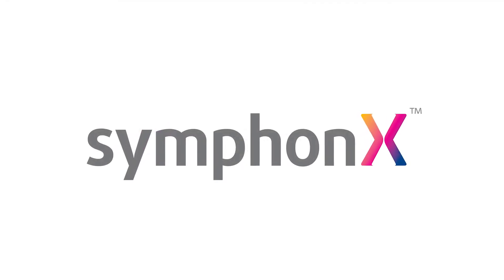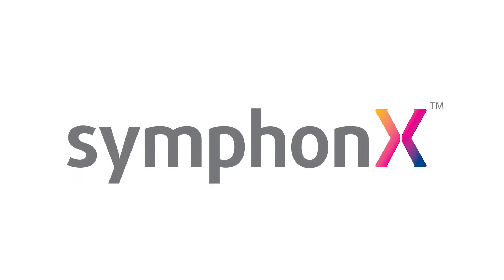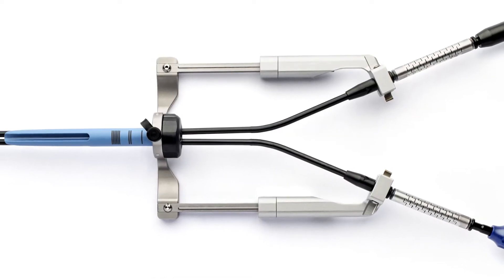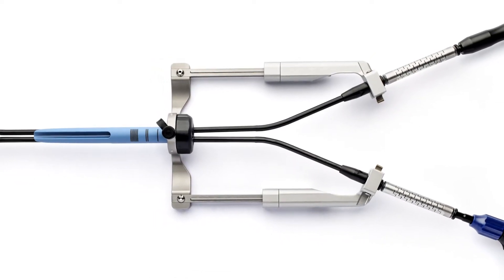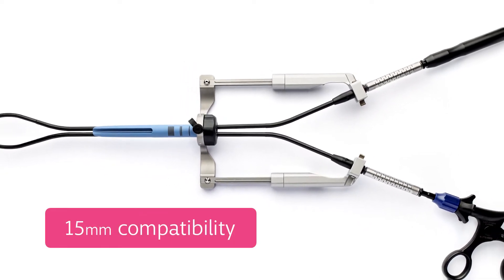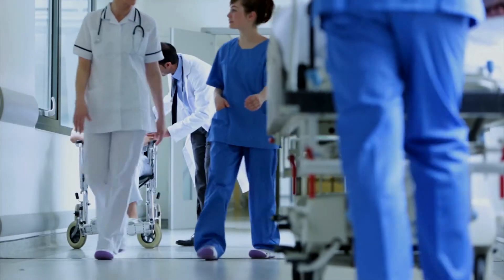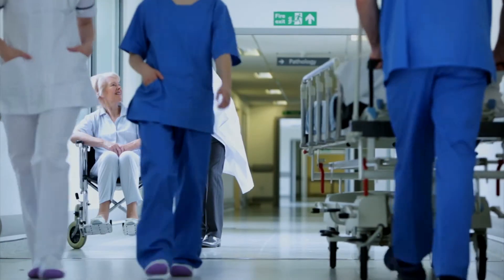Introducing Symphonics, the surgical solution that truly delivers on the promise of single port surgery. Symphonics is the first and only single port platform compatible with the standard 15 millimeter laparoscopic trocar, promising fewer port site complications, less post-operative pain, faster recovery, and exceptional cosmesis.